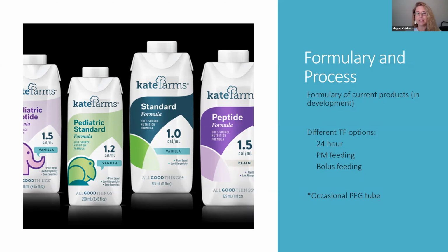But there are a few different ways that we can offer tube feeding support. So just to let you know what those are, the first is a constant run. So anywhere from 21 to 24 hours would be considered essentially a 24-hour tube feed, meaning that they are connected to the bag and the pump throughout the entire day. For those clients, they will have a pole that is on wheels that has the bag and the pump on it, and they will have to take that pole everywhere that they go. So you can see how that's a pretty intensive process and a constant reminder you're getting your food. But necessary and helpful for some, just not always the most ideal.